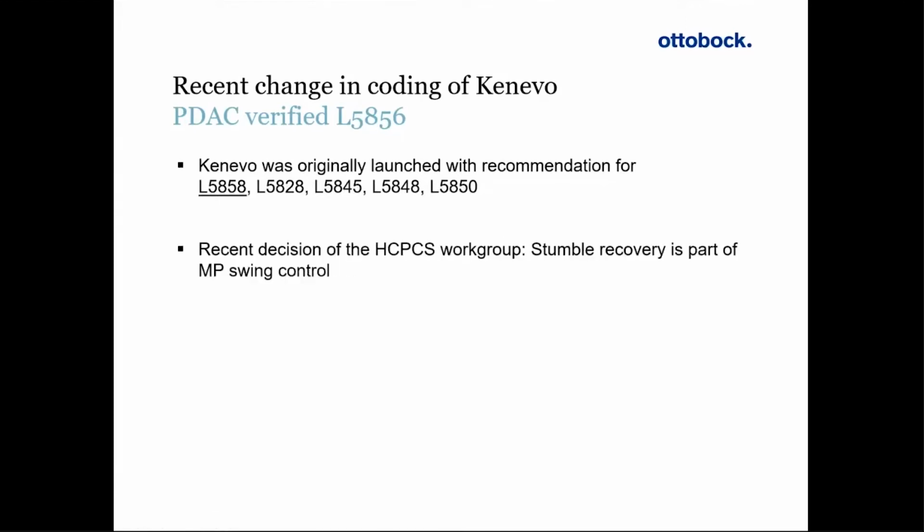Then we made the experience, we actually applied for the change of the language in the C-brace code. We wanted the HCPCS work group to add the stumble recovery as one of the important features to the L2006 C-brace code, but the HCPCS work group denied that request and said that from their perspective, stumble recovery is part of microprocessor swing control.